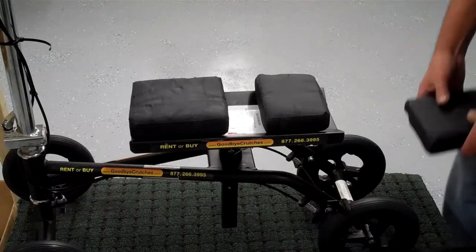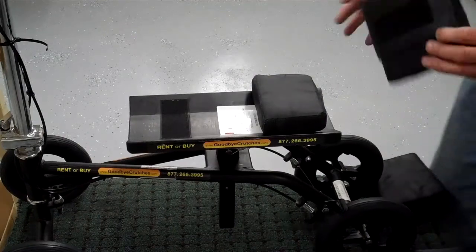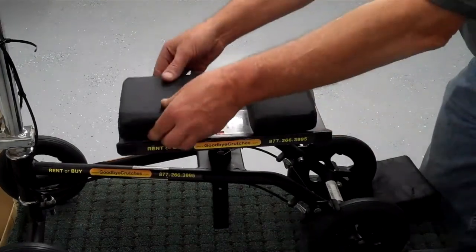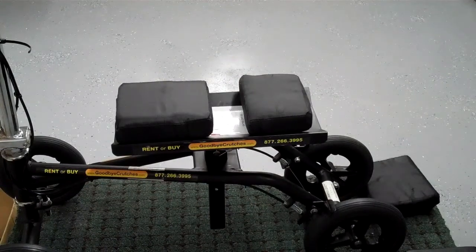To replace them, simply grab the old pad that's been velcroed down, pull it off, and place the new pad on. That's how you do it. The rear pad works the same way and can be adjusted to fit your cast or bandage.